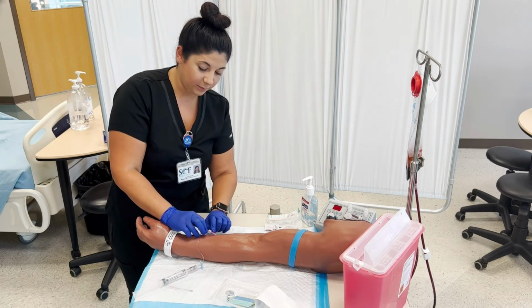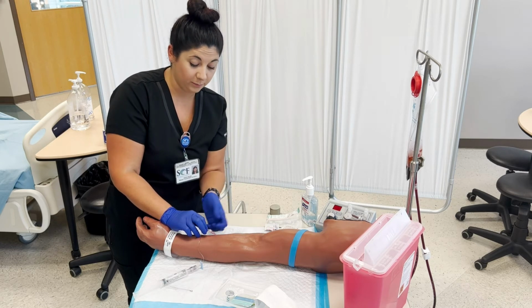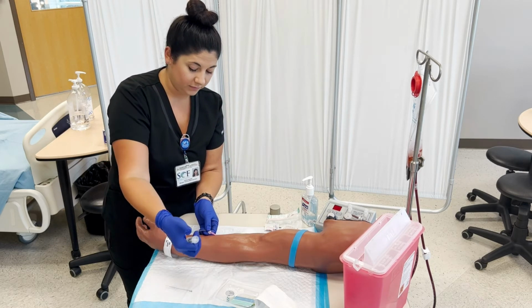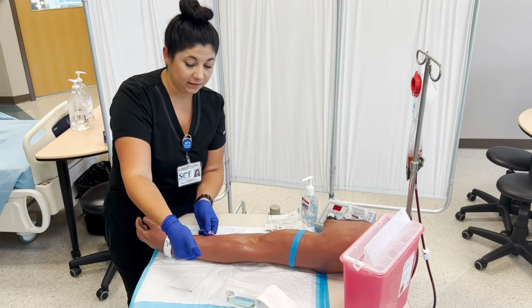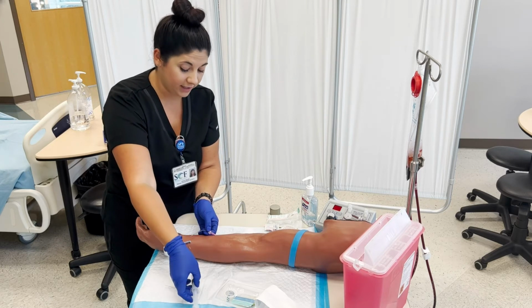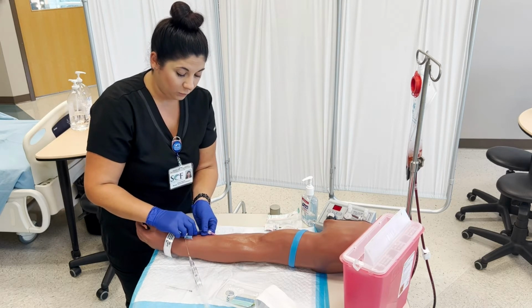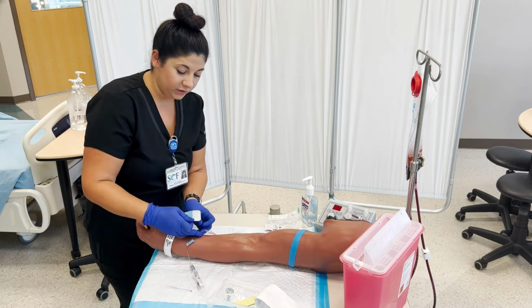And make sure you're stabilizing this the whole time. You don't want to let it go, because if it flops to the side, it can bend the catheter. And then you go ahead and flush. It should flush easily. If you're having to push hard, you're not in the vein and you should pull it out and try again. So once I have verified that I'm in that vein, it flushed well, I'm going to dress it.